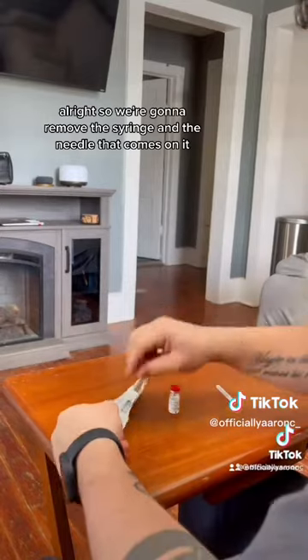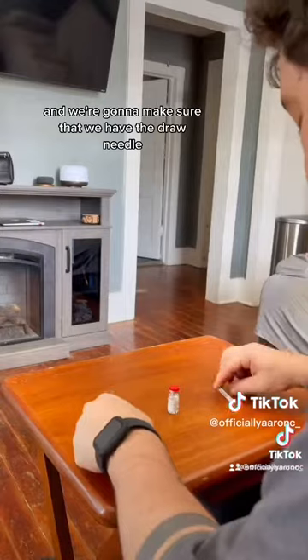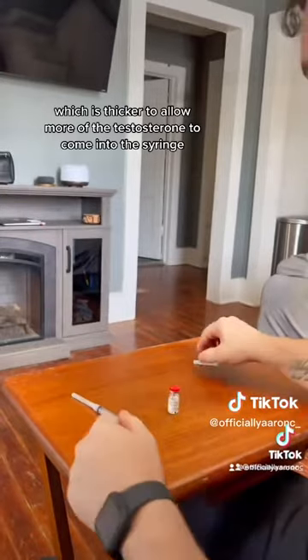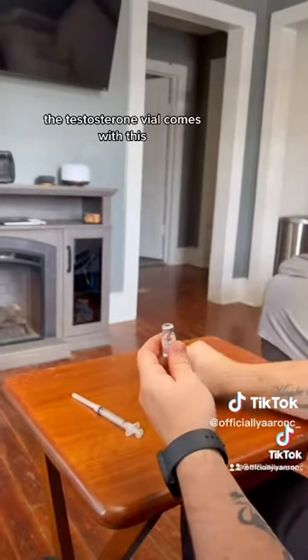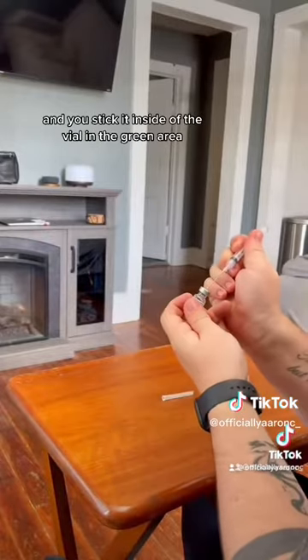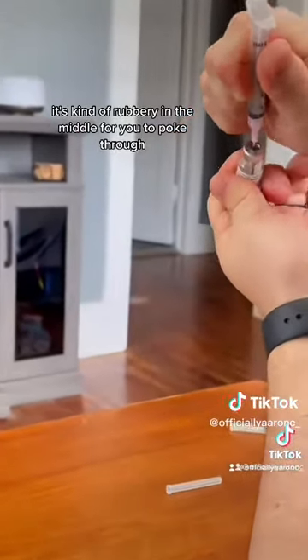Alright, so we're going to remove the syringe and the needle that comes on it from the package. We're going to make sure that we have the draw needle, which is thicker to allow more of the testosterone to come into the syringe. This is how the testosterone vial comes — with just that red cap, it's kind of like a safety seal, so you pop that off. You take the cap off of the draw needle and stick it inside the vial in the gray area, which is kind of rubbery in the middle for you to poke through.